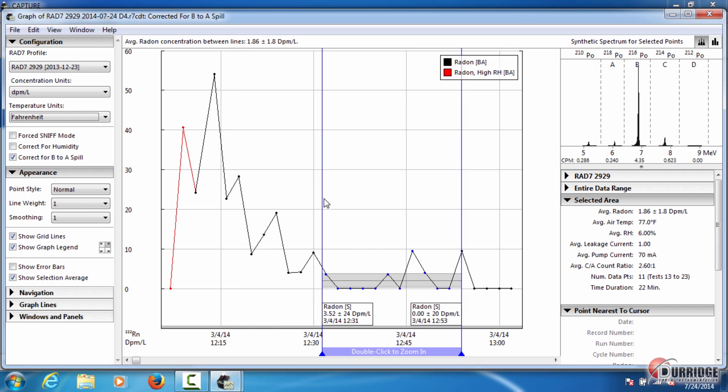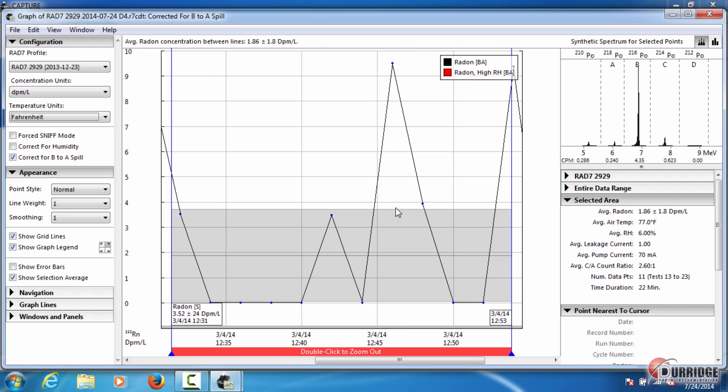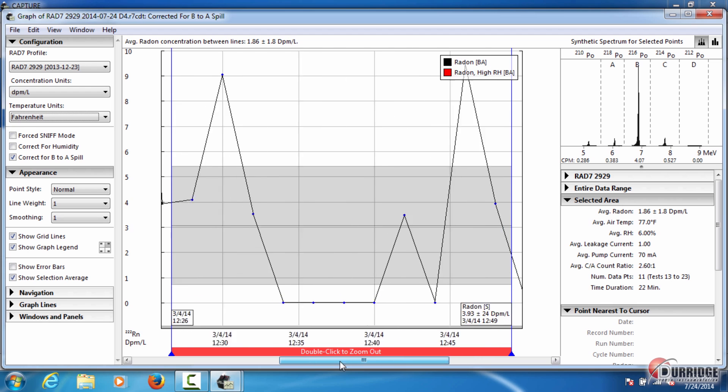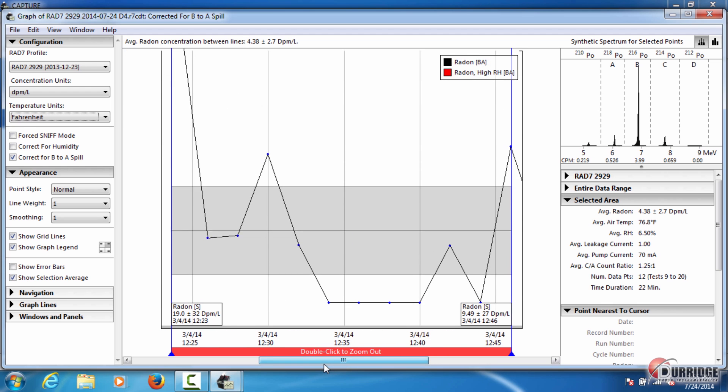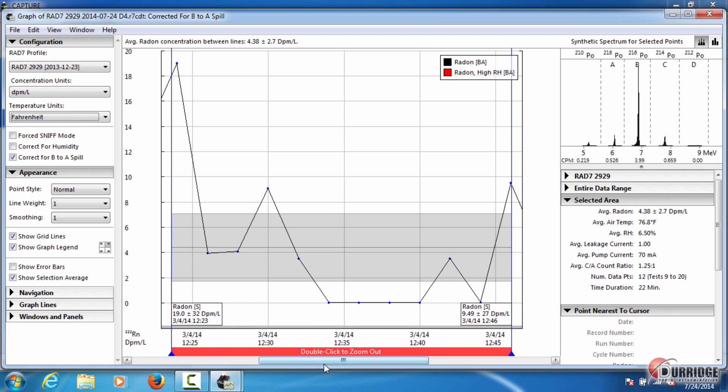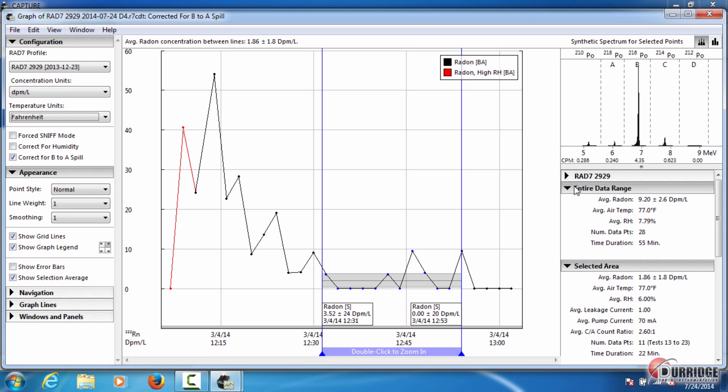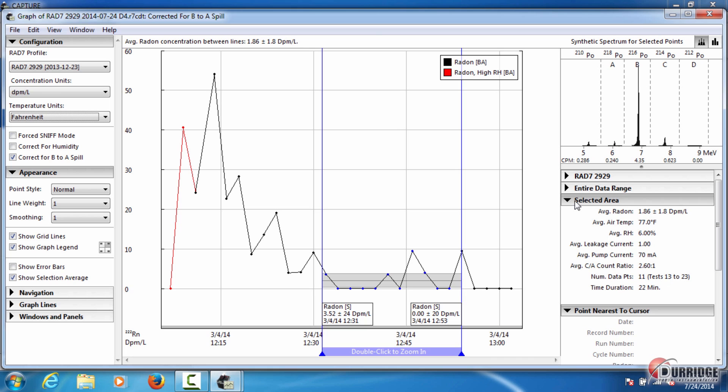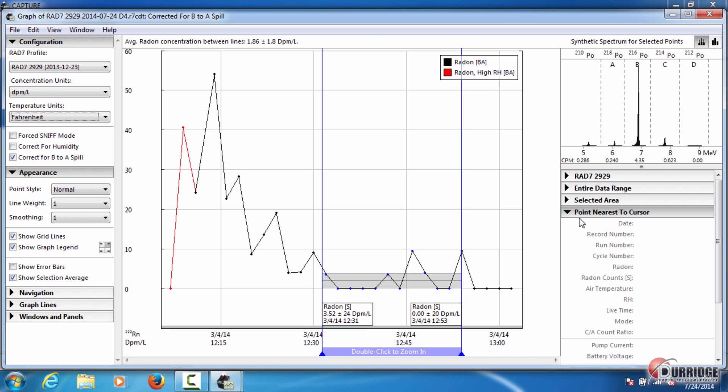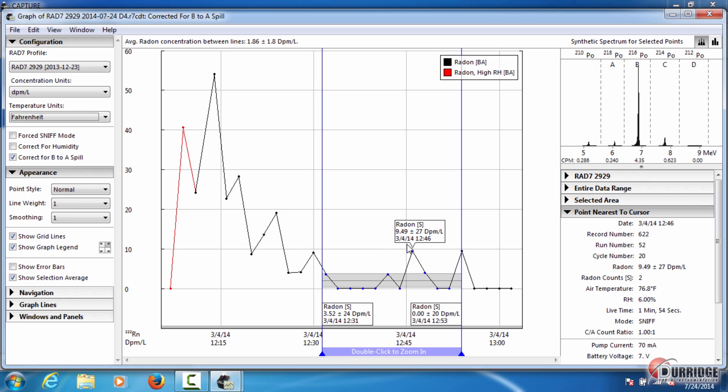To view a graph region in more detail, double click the area between the selection bars. The view will zoom. It can be navigated using the horizontal scroll bar at the bottom here. Double click between the selection bars again to zoom out. Statistical values are displayed for all of the data in the entire data range panel here, and for a single point in the point nearest to cursor panel. These values change depending on where you place the mouse cursor.